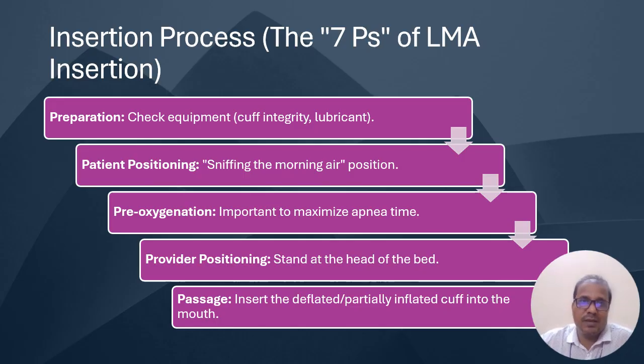That is very important for juniors and learners: the insertion process of the LMA. At first, we must prepare the patient and prepare the instrument. Prepare the patient, that is, the patient must be on an empty stomach, not a full stomach, and proper fasting condition is mandatory.